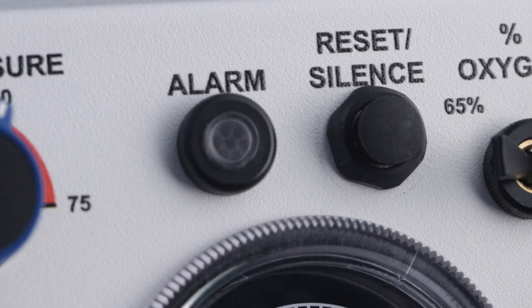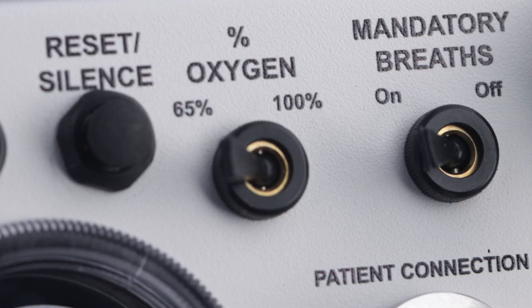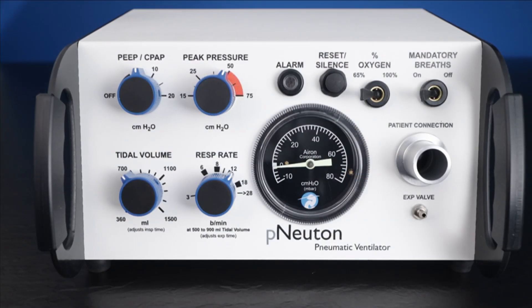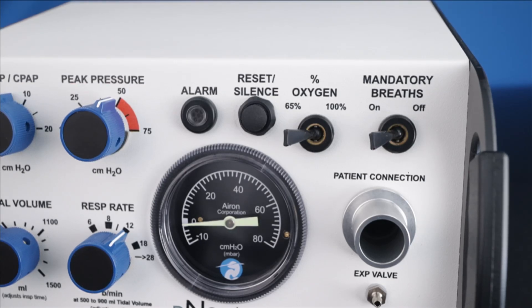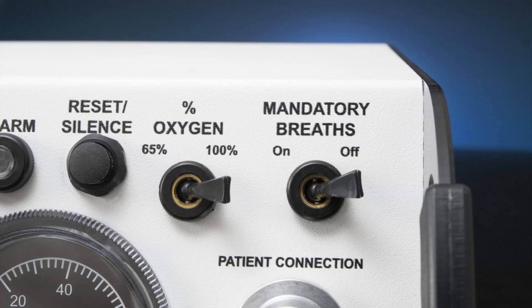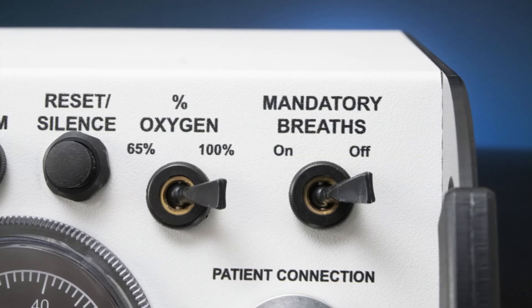Percent Oxygen Control. To the right of the alarm reset is the Percent Oxygen Control switch. With the ventilator driven by 100% oxygen as the source gas, the Model A's Variable Oxygen Control system allows the clinician to choose either 65 or 100%. Both mandatory and spontaneous breaths are delivered at the set oxygen level. The high flow Venturi provides stable performance up to the maximum operating pressure of the ventilator. The mandatory breath control to the far right allows you to toggle on or off. In the on position, the ventilator will deliver the preset tidal volume and respiratory rate. With the mandatory breath switch in the off position, the ventilator will provide CPAP only for the spontaneously breathing patient via an endotracheal tube or a face mask.